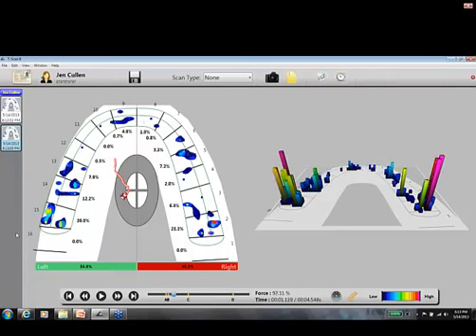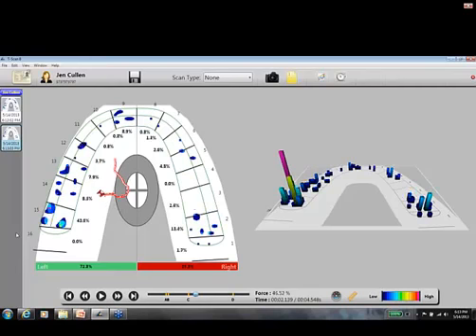I'm closing. And we're going to see me slide to the left in a second. So I'm moving to the left. Now let's look at how number 2 stays in.